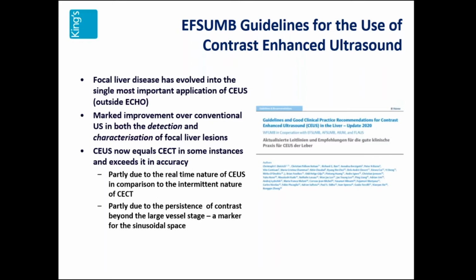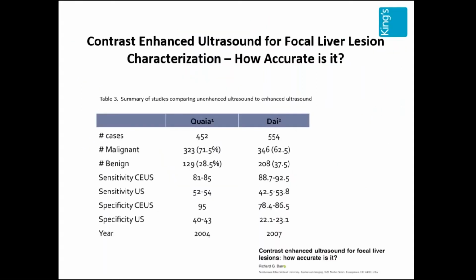And more importantly, the ultrasound contrast agent is truly intravascular. It's not leaking, there's no equilibrium phase. So if there is washout in that lesion, you will see washout.